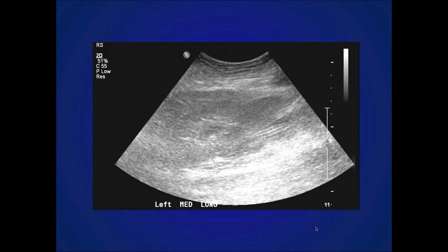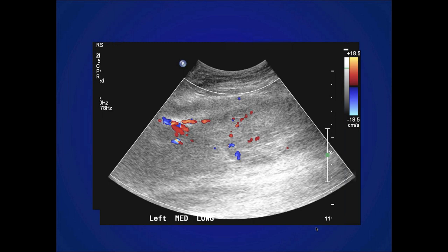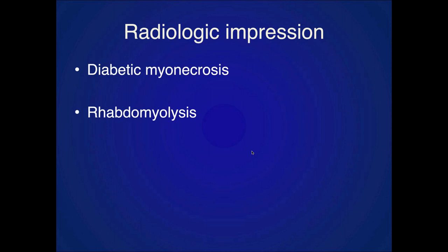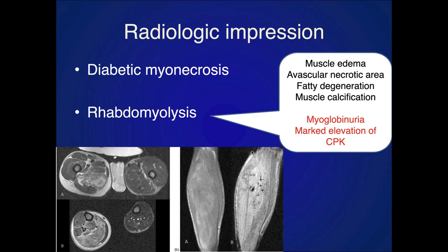On ultrasound of that area, there's an amorphous low-signal region with scattered areas of vascularity within it. The impression was diabetic myonecrosis and rhabdomyolysis — it looks like necrotic tissue.